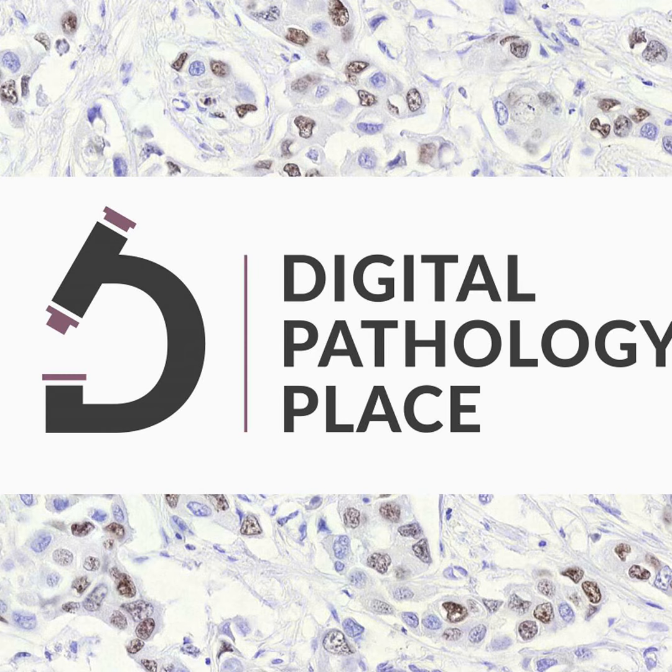Telepathology was born out of necessity, due to the geographical dispersion of patients and the limited availability of pathologists, especially in remote areas. Before the advent of this technology, tissue samples had to be physically transported for diagnosis, which was both time-consuming and could result in the degradation of samples. Telepathology helped to eliminate these challenges by enabling the transfer of digital images of pathology slides to pathologists located elsewhere for timely and accurate diagnosis.